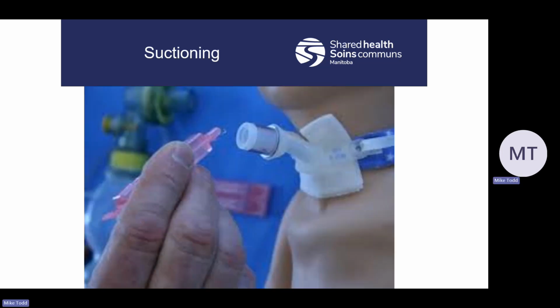If there are very stubborn or very thick secretions that are hard to clear, like they're just stuck there, maybe that's why the patient needs that help. You can actually put about 3 to 5 mLs of saline into the trach and then suction right away. So get your suction tube in there, put some saline in, and then suction right away, because obviously we're not going to start pouring saline down their throat and let it sit. So we want to get that 3 to 5 mLs of saline in and start suctioning right away, and hopefully that'll loosen up whatever phlegm or clogs are in the trach.